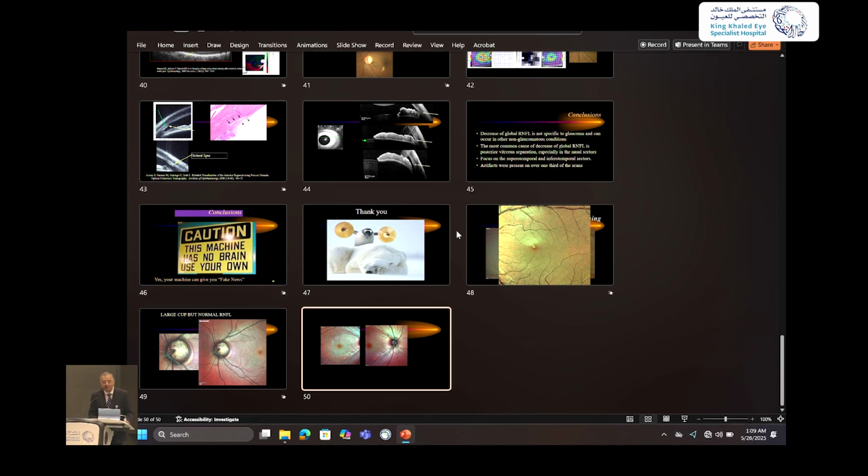Regarding the OCT and detecting glaucoma progression in the event of AMD, age-related macular degeneration, any recommendation on how to tell if it's progressing or not? Yes, a very good question. Any macular pathology, such as age-related macular degeneration, will cause a loss or increase of tissue thickness in the center.